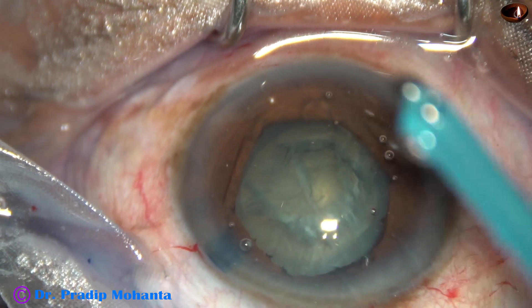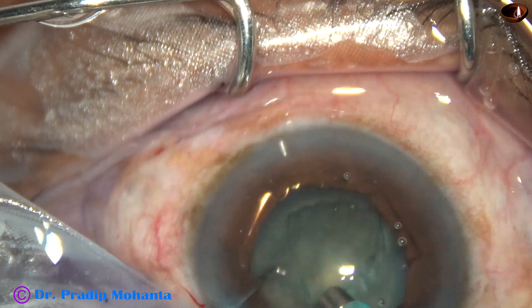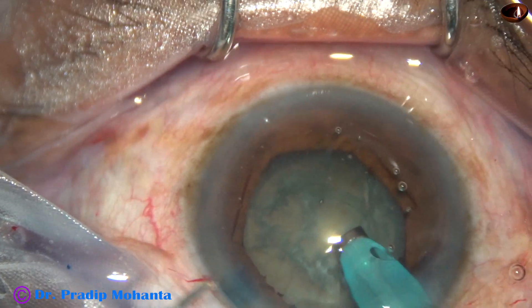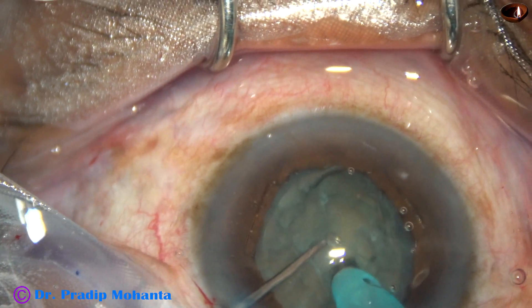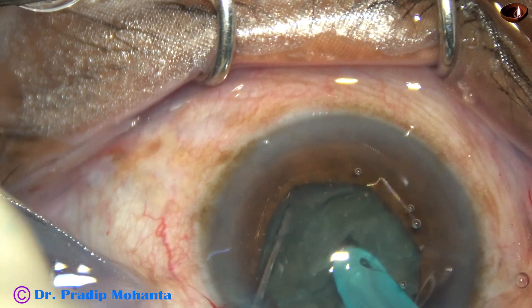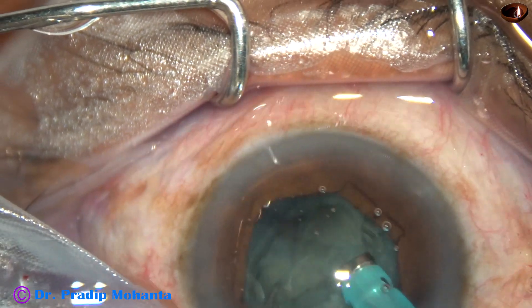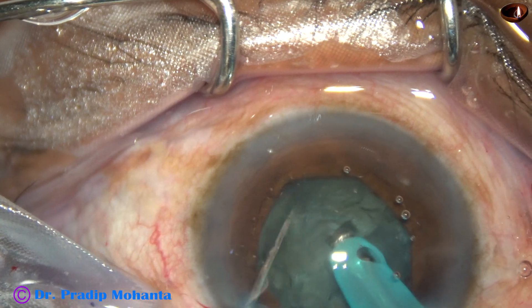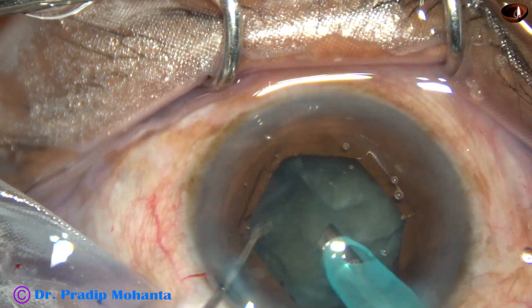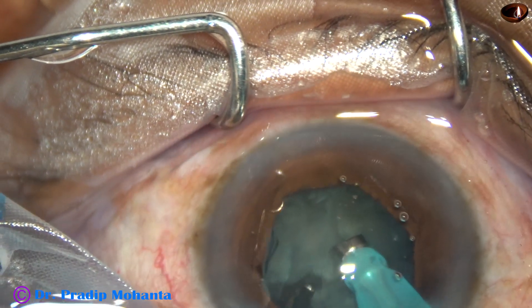Now is the time to introduce the tip of the phaco handpiece. The machine being used is the Oertly Easy FACO machine — it is a very economic machine but has great power to conquer even a very hard cataract. It is very nice to hold the nuclear mass, and for direct chop, this is one of the best machines in the phaco industry. I have now chopped the nucleus into some fragments, but as I try to emulsify each fragment, I find I am just eating off the lens piece, so in such cases we have to be extremely careful.